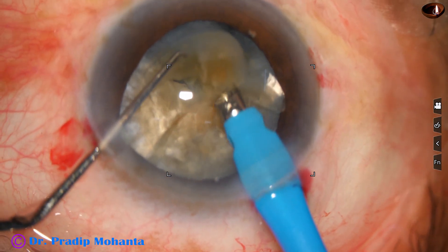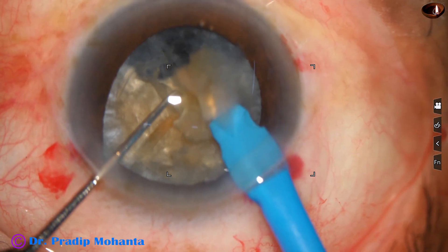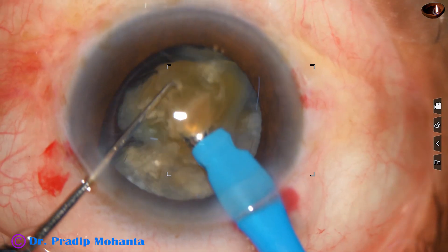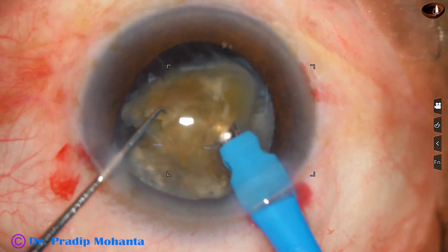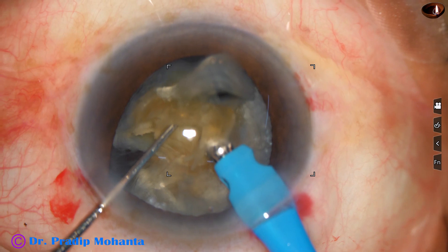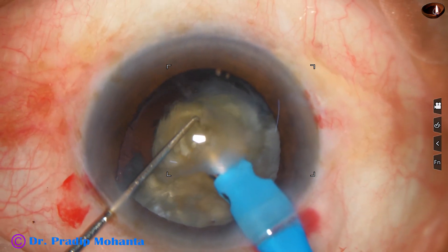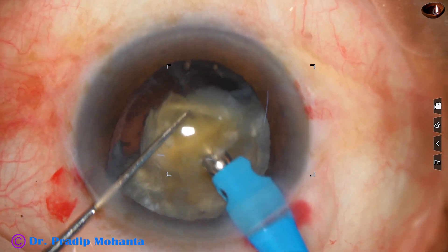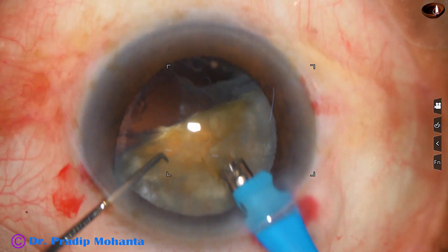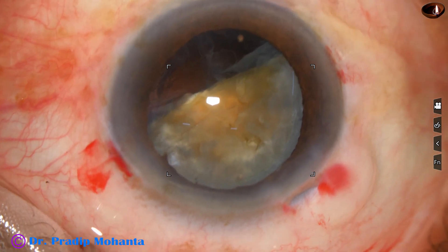Ultrasonic energy is 80% in continuous mode, but I use it intermittently — only for a fraction of a second or a few seconds at a time. Ultrasonic energy is being used now and the nuclear fragment is being emulsified. At this time we have to take care of the stability of the anterior chamber. We also have to keep an eye on how the posterior capsule is behaving.